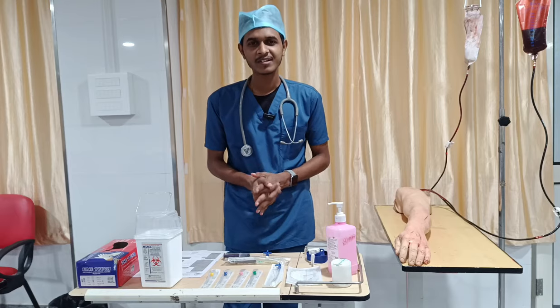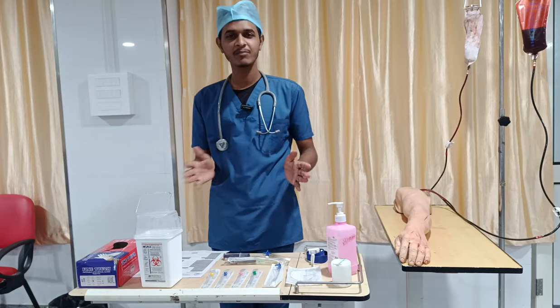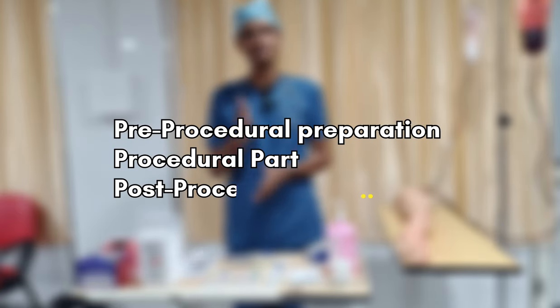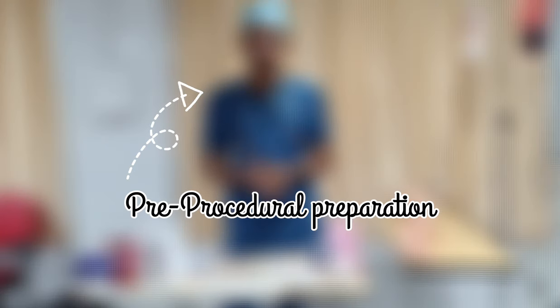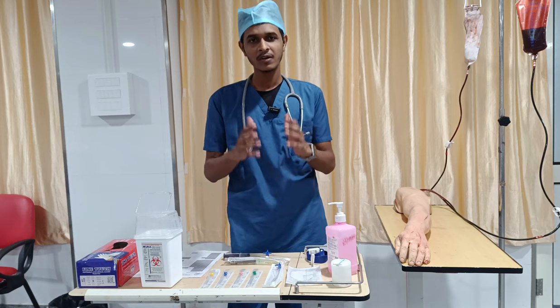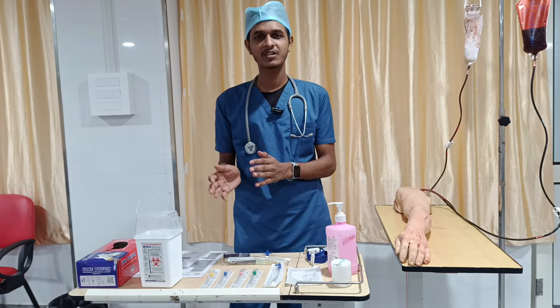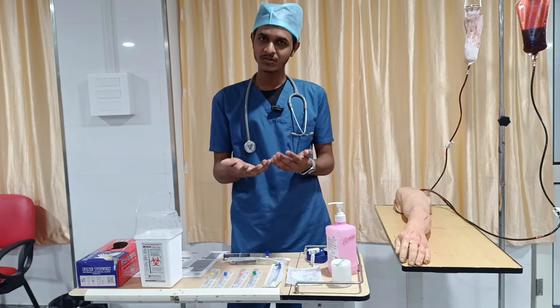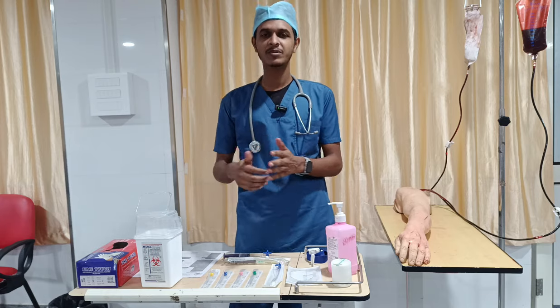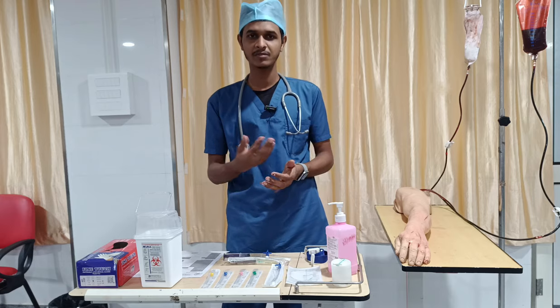In the procedural part, we are going to divide it into three portions: pre-procedural preparation, the procedural part, and the post-procedural things we have to do. First, pre-procedural preparation. What are the things you have to do? Before preparing all the equipment, you have to get to the person. First, you have to introduce yourself. You have to stand on the right side of the person, introduce yourself, and greet the person.